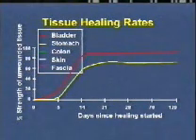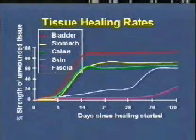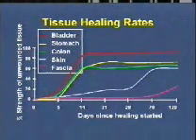It can be seen that some heal quickly, like bladder and bowel. Others are much slower, especially fascia, which has only regained 70% of its original strength after 1 year. Skin is slow healing, but it is thought that the high elastin content allows the early removal of sutures without wound breakdown. The diagram shows the variation in wound repair time for some commonly incised tissues.